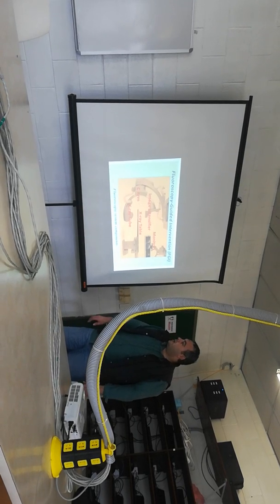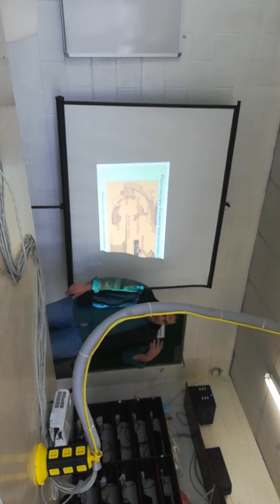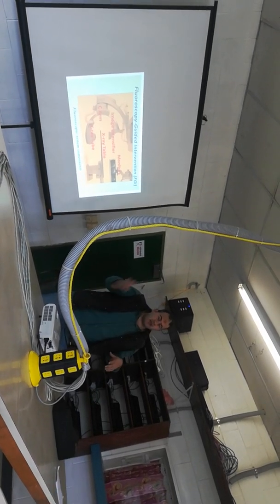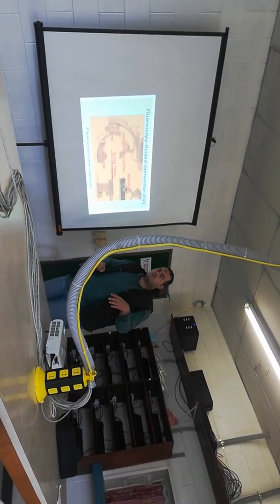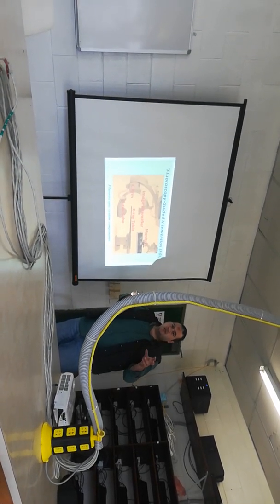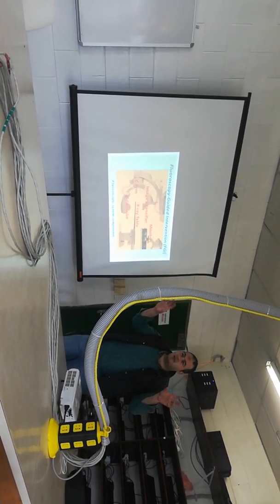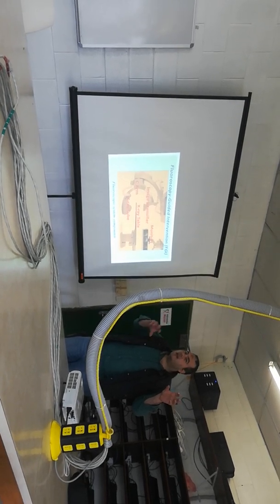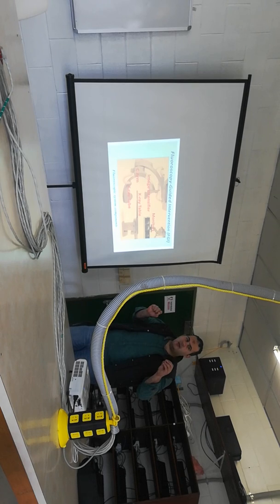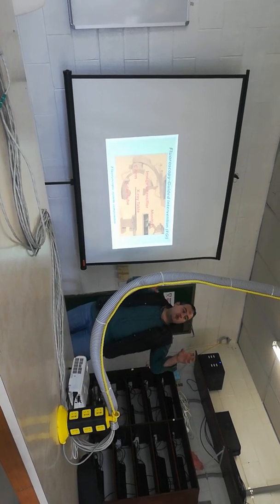X-ray tube, as we discussed before, is a source of X-ray, and we discussed that for X-ray production we use cathode and anode, using kV and milliampere. You set these parameters to control the output of X-ray.